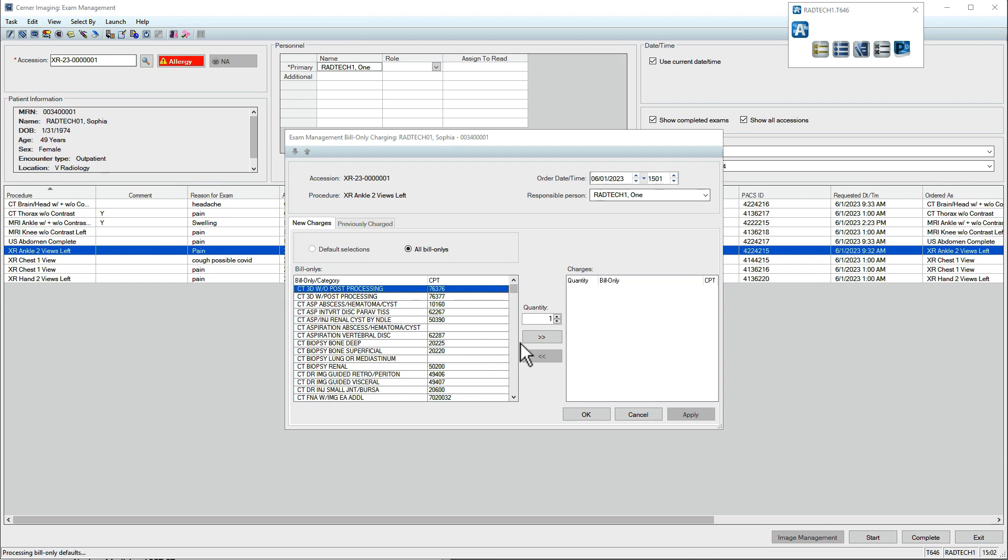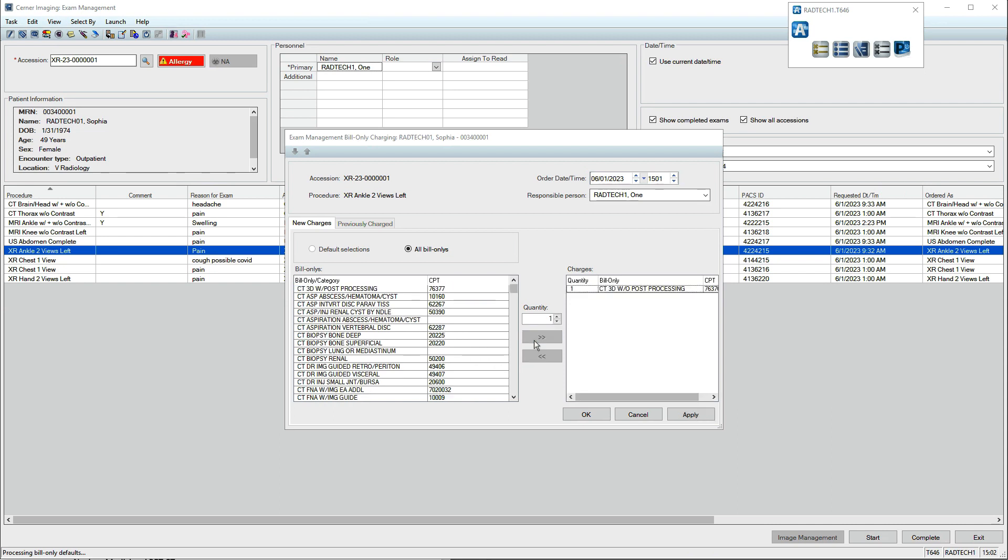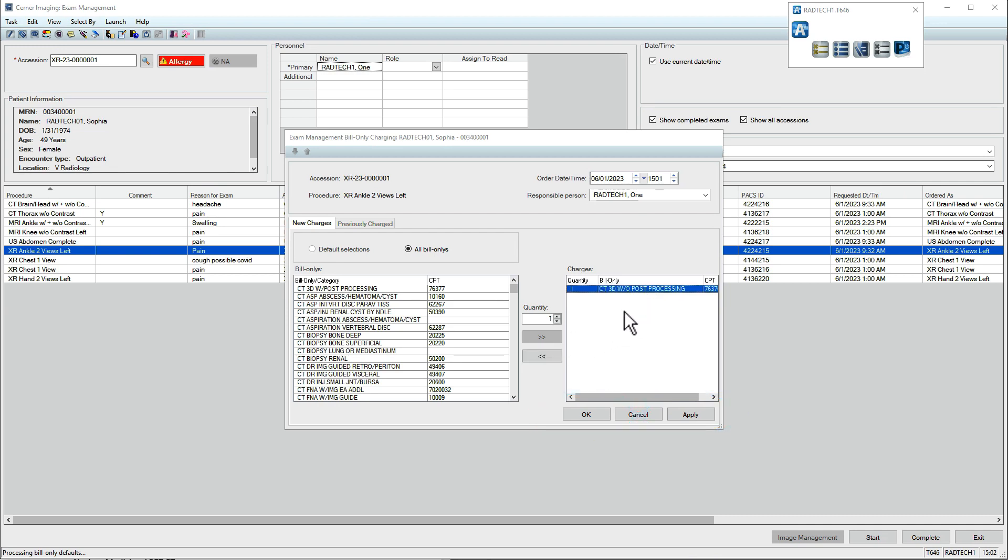Charges you're applying appear in the list on the right. When finished, click Apply, then click OK. If you added a charge mistakenly, select the charge and click the left-pointing arrows.